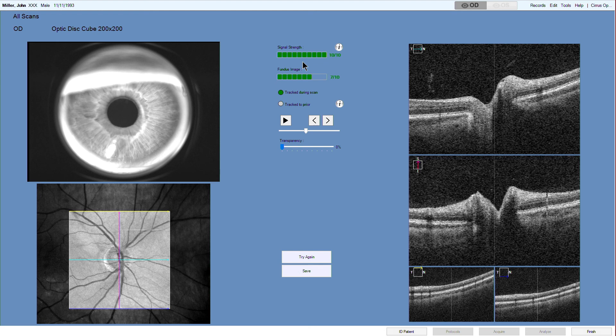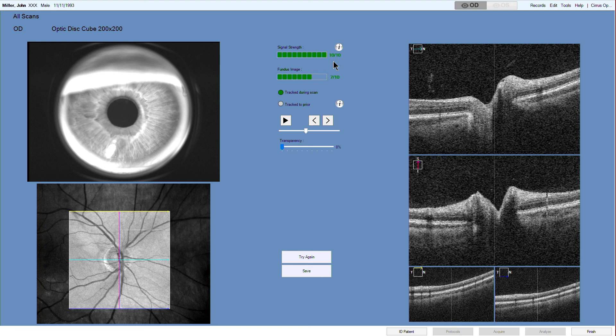Once data acquisition is complete, scans must be reviewed for acceptance prior to being released for analysis. The scan quality check screen appears automatically upon completion of data acquisition.